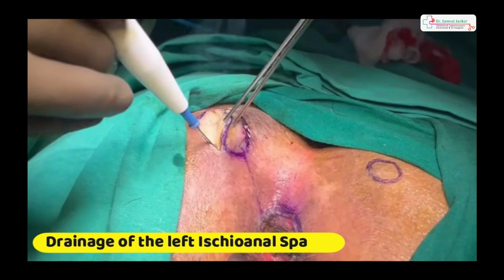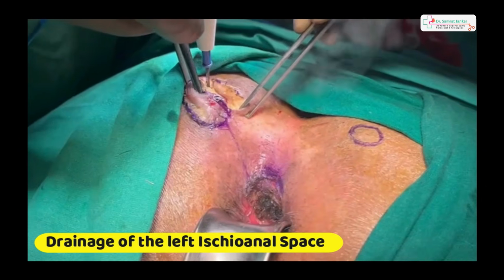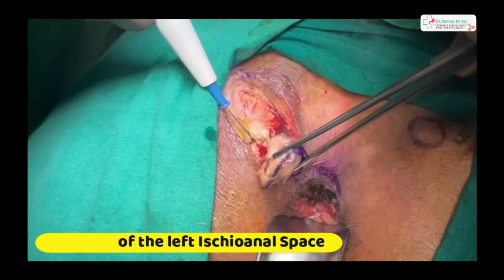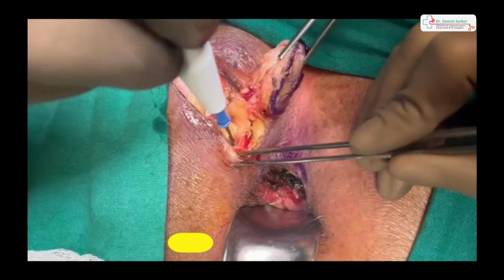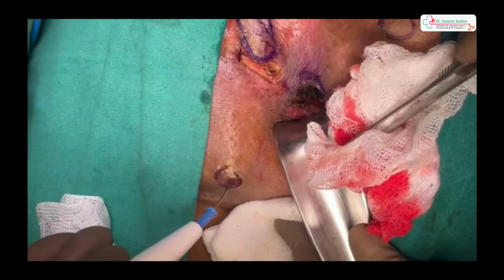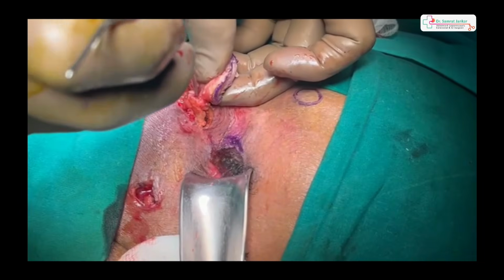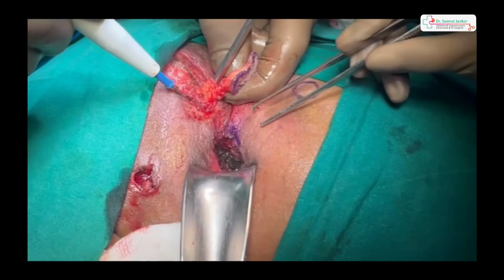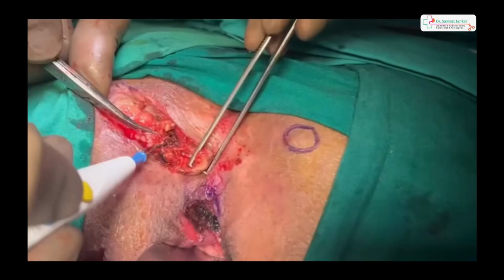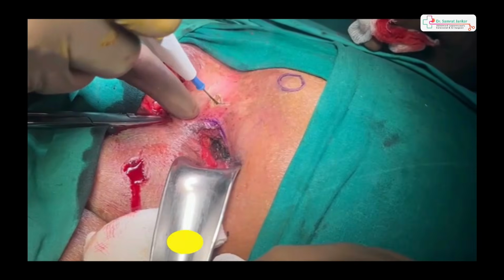We are very much clear, knowing that the 5 o'clock external opening is going, we just map out on the patient table what is seen on MRI, so that it is very less likely we miss something. We take a track as it has been shown on MRI, reaching to the external sphincter, and then we are digging out the infralevator component which is going along the external sphincter on the left side till the levator lower margin.